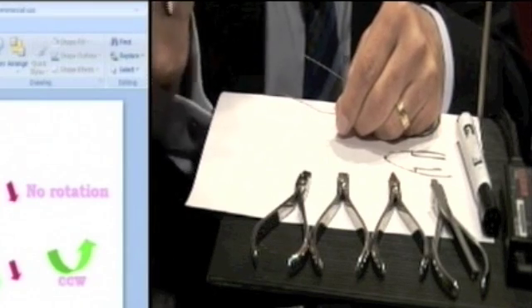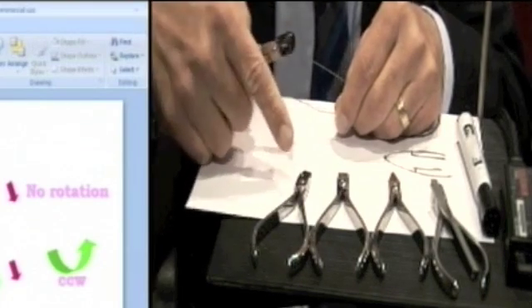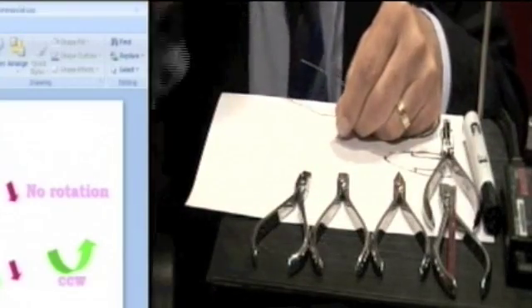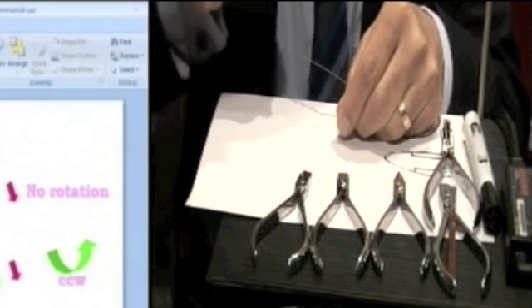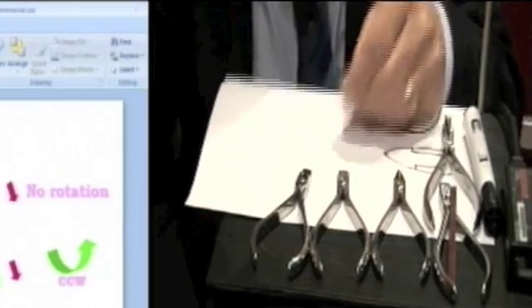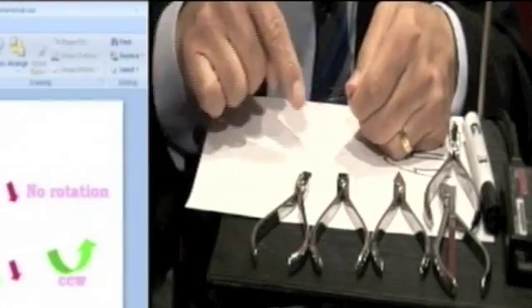Now you don't need that plier. You can, of course, do this with your tweed pliers. But then there's a lot more wire bending involved. Because you've got to put one bend, put another bend, then go put one more bend, and then you're going to introduce unwanted torque. This plier, the wire stays nice and flat.